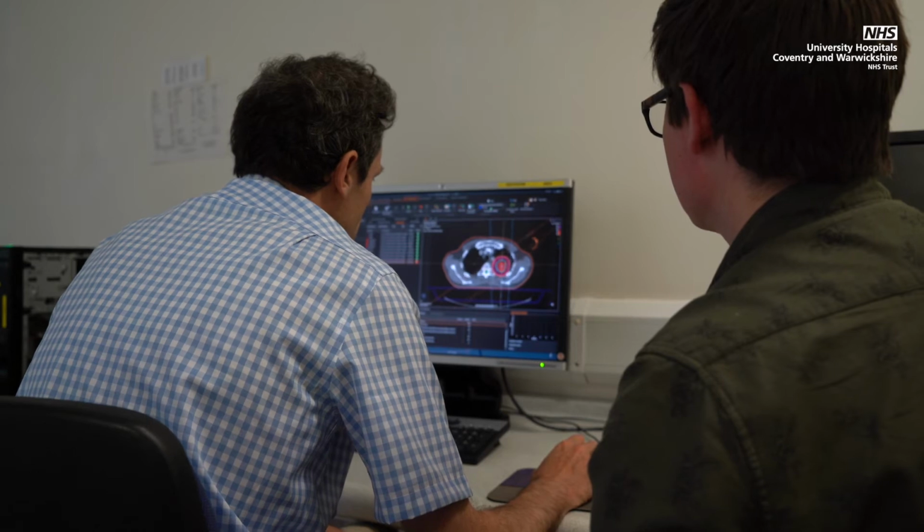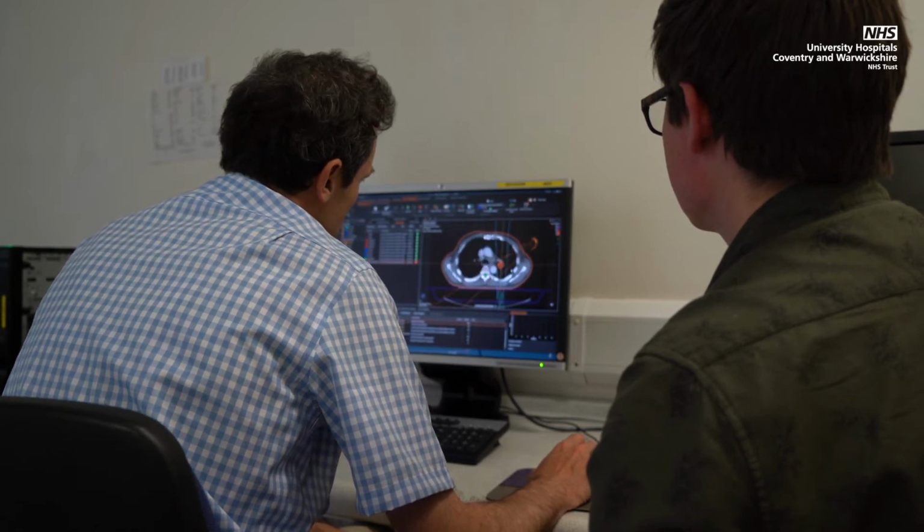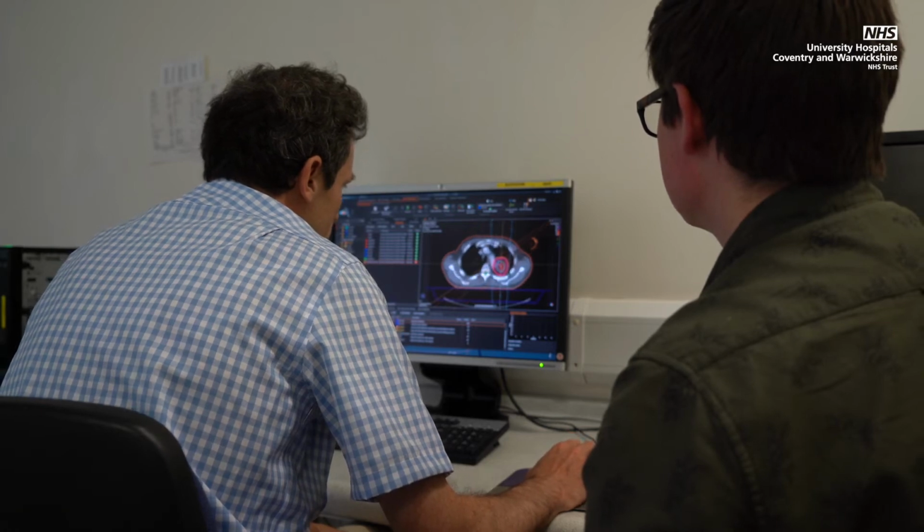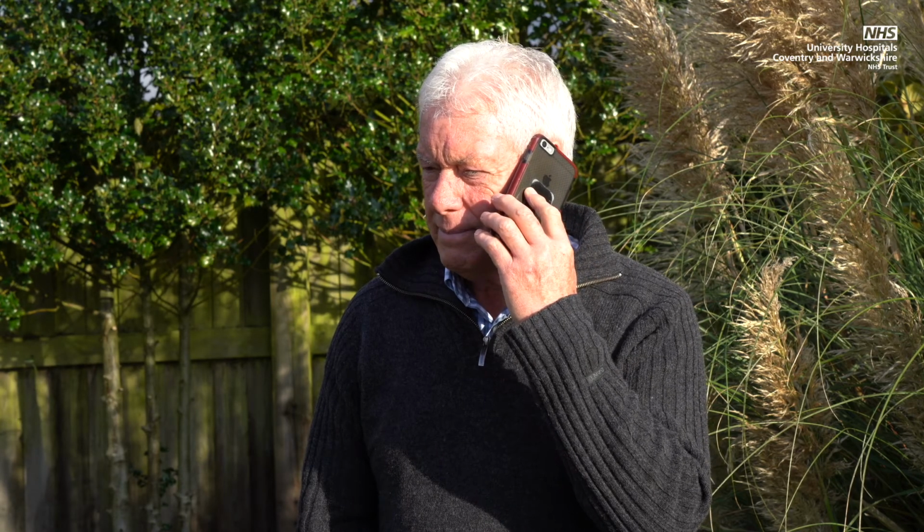Due to the complexity of radiotherapy and the planning process, it can take up to 4 weeks for you to receive your first radiotherapy treatment appointment. During this time, the doctor will use your CT scan to highlight the exact area that they want to treat. After this, physicists, dosimetrists and radiographers will carefully plan and prepare your treatment to determine the exact dose and technique required for you. When your treatment plan is ready, you will receive a phone call informing you of your first day of radiotherapy treatment.